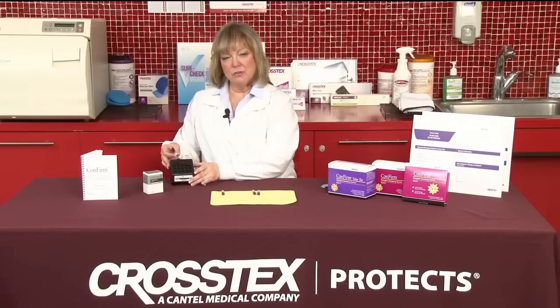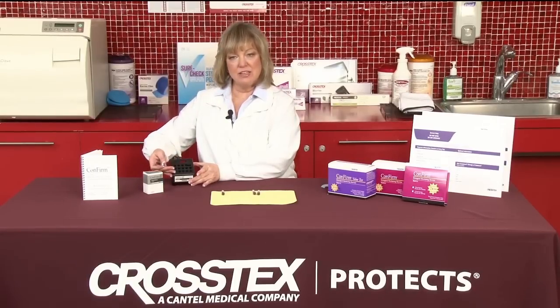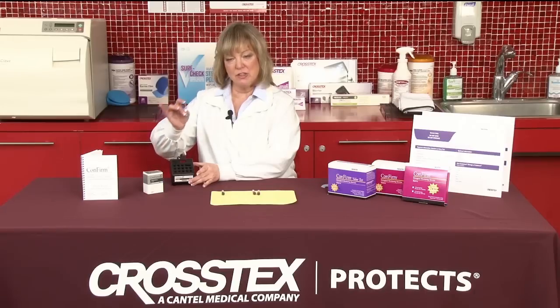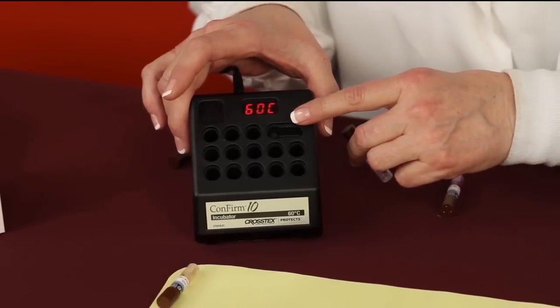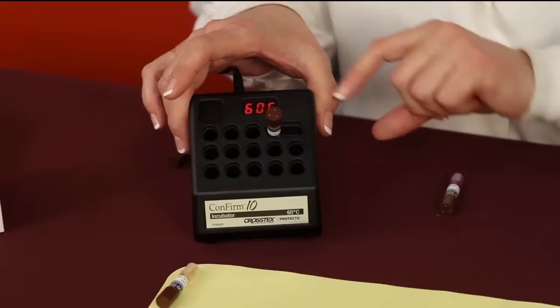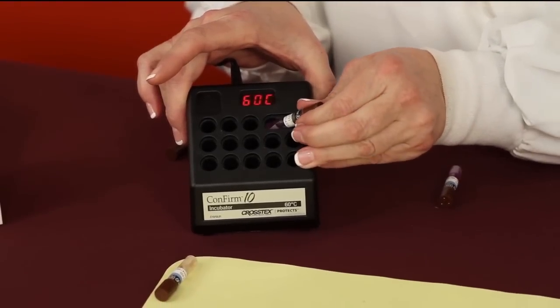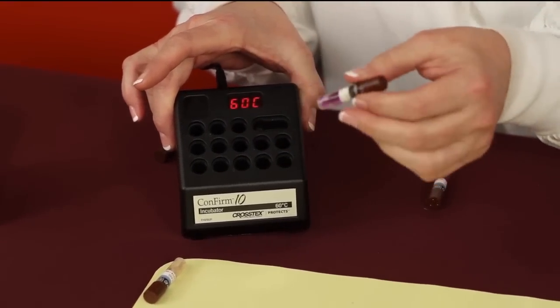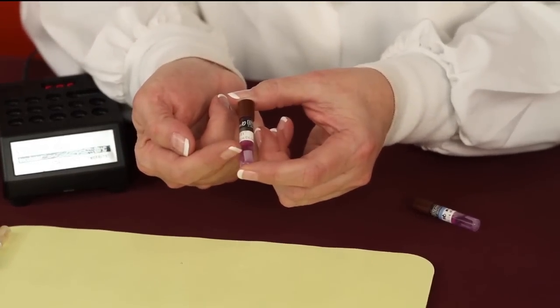The way that's accomplished is we're actually going to crush that inner ampule of the vial. With the confirm incubator, you'll see that there are 13 individual spots that the vials can be placed. In the very back, you'll notice that there is a longer opening. If we place that vial into the opening and gently tip it to the side, you'll hear an actual pop, and that means that the glass ampule has been broken. At this point, you'll now see that the spore strip is surrounded by the fluid.